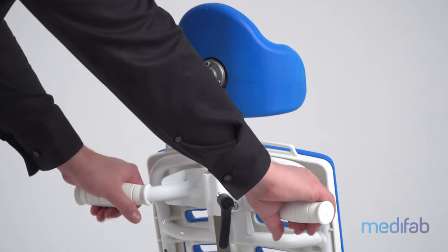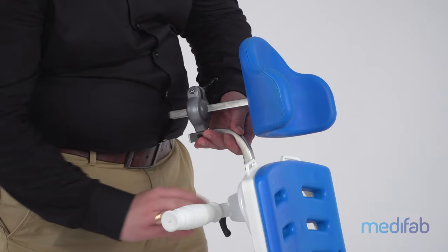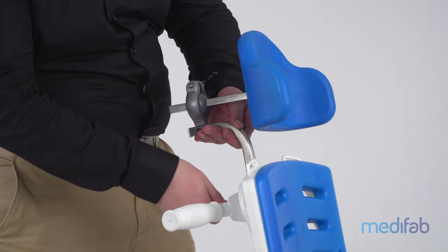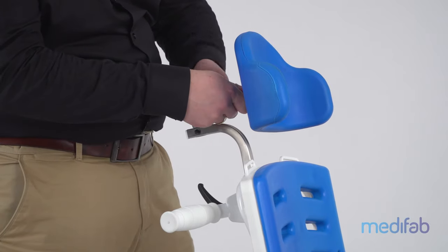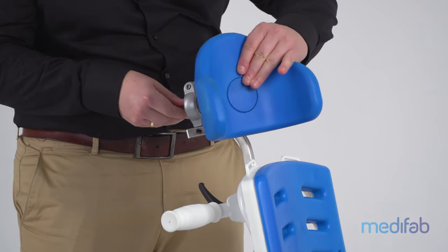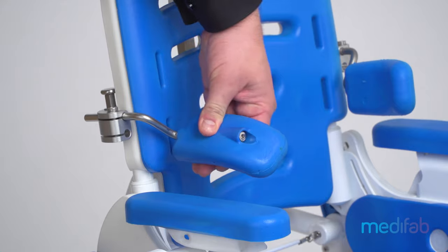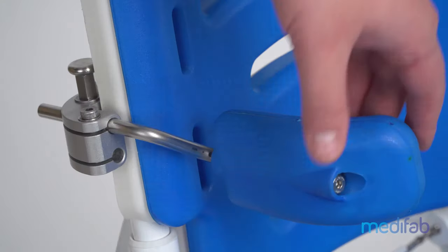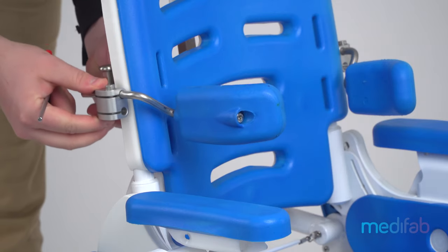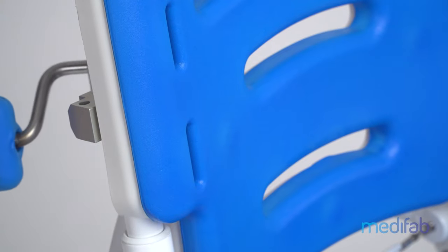Stable push handle for optimal maneuverability. Height-adjustable and multi-axis headrest with water-repellent polyurethane padding. Lateral pads are not only adjustable in angle, but also in width and in height. In addition, the pads can be swung away.